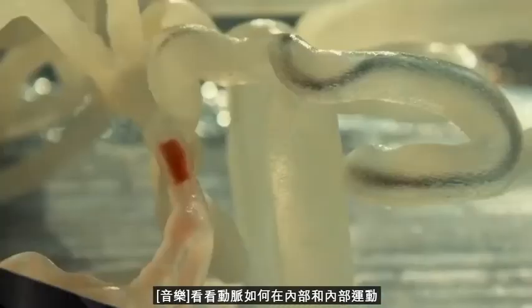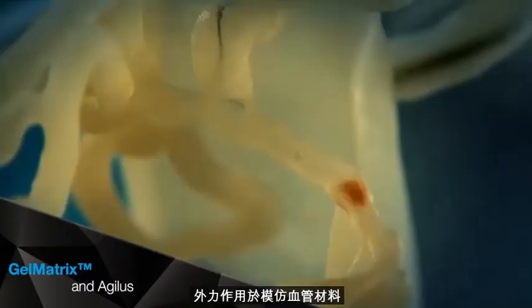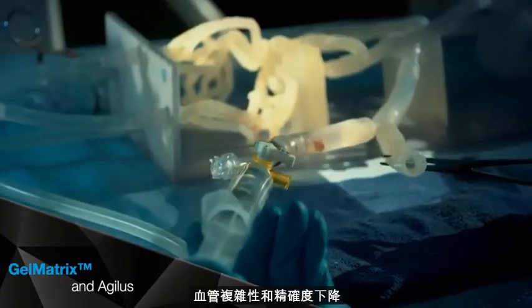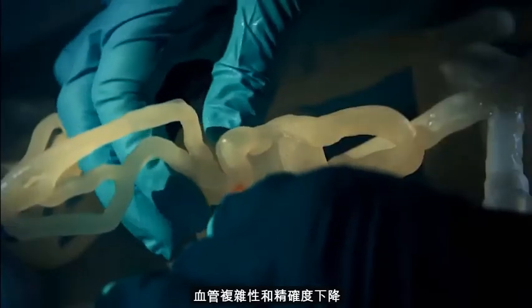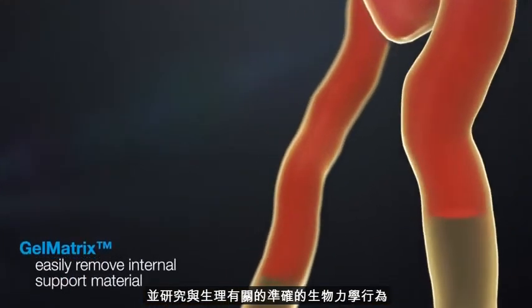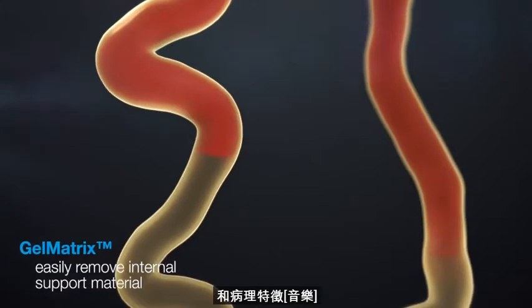See how the artery moves as internal and external forces are applied with blood vessel material that mimics vessel complexities and degeneration with precision. And study the accurate biomechanical behavior associated with physiological and pathological characteristics.